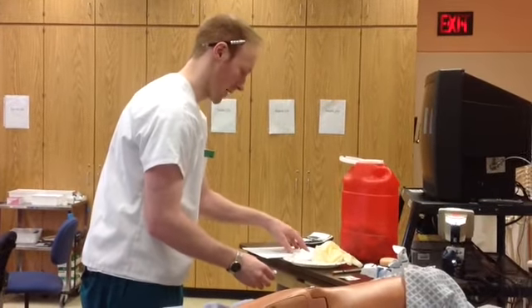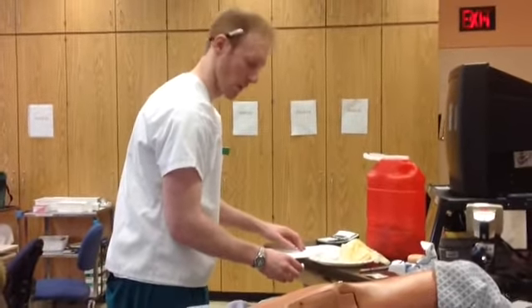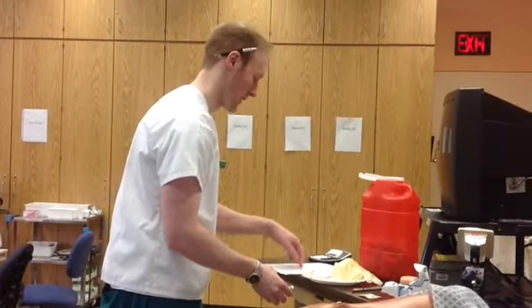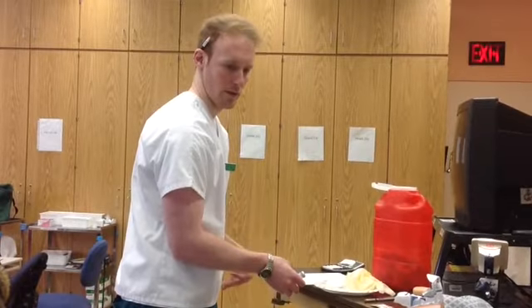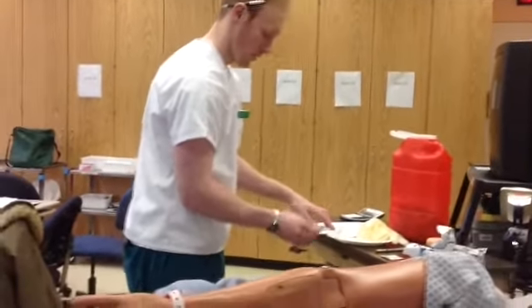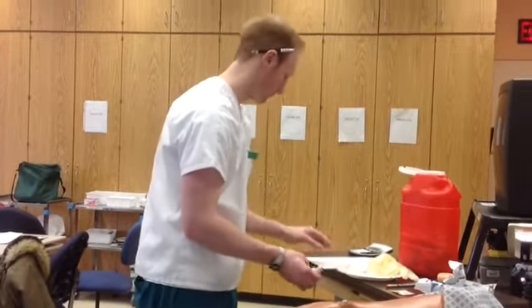Date of birth is 11XXX. It's going to be taking 2.4 million units. 2 million units, I'm going to have to do some math. It's going to be taking it intramuscularly, and it's going to be taking it in his ventral gluteal site on his right leg, intramuscular. Weekly for 6 months. And the reason why he's taking it is for infection.